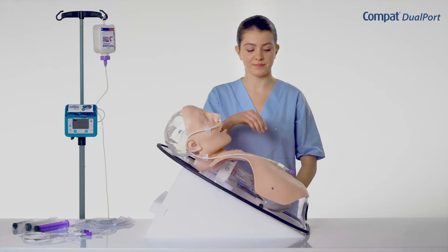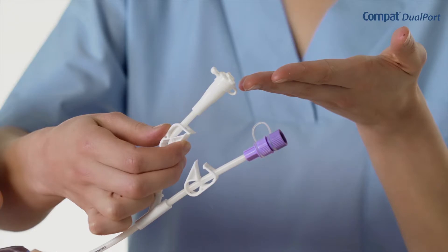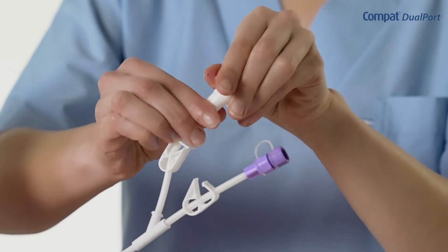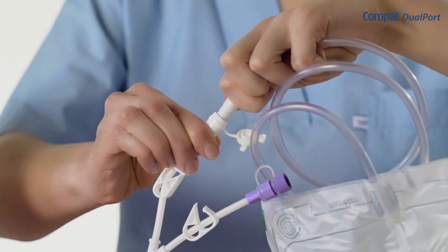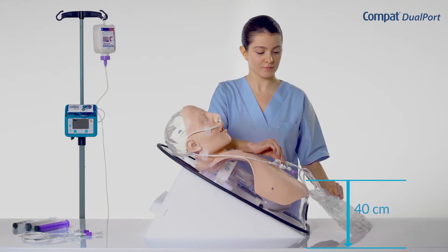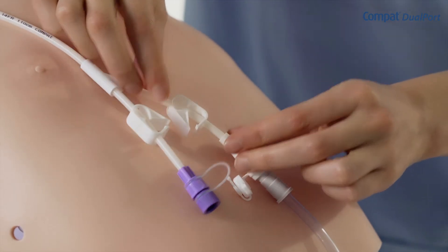Compact Dualport also has a funnel port compatible with most drainage and aspiration devices. To drain the gastric residuals by gravity, make sure that the clamp is closed and connect the collection system to the drainage port. Place the bag approximately 40 cm lower than the stomach of the patient and open the clamp to begin the drainage.